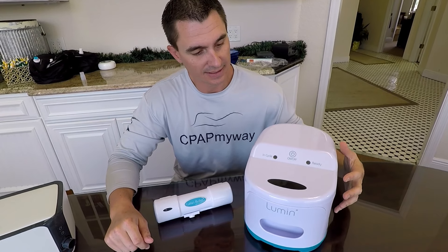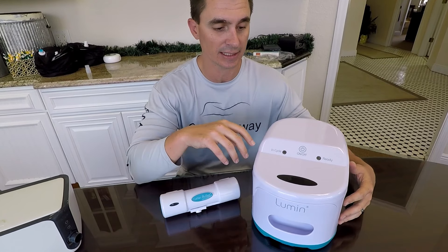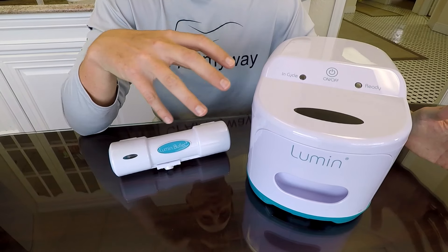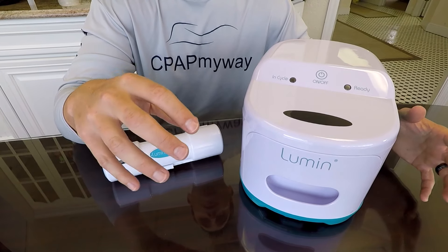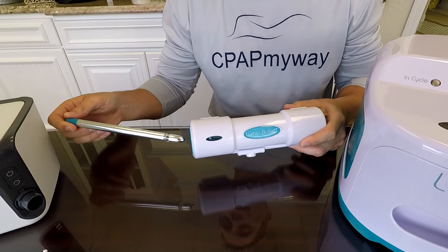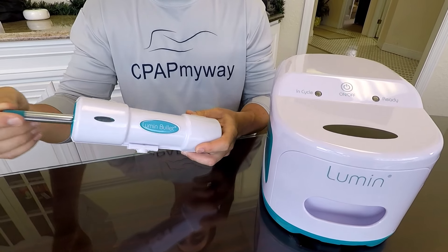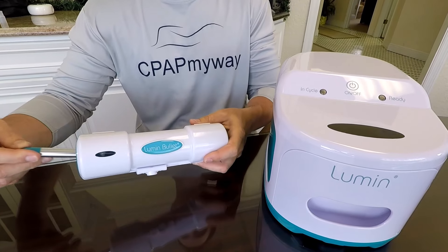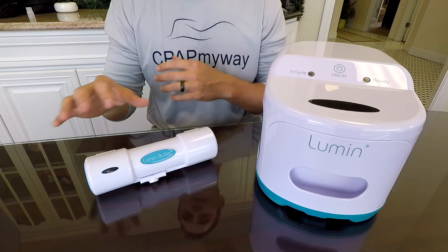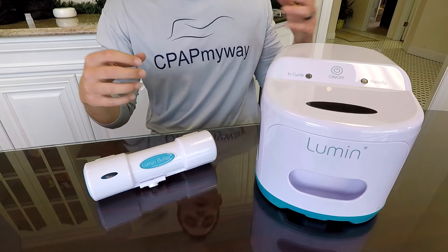The last model we've got for you today is the Lumin and Lumin Bullet. These are a big departure from the previous models because they are UV light cleaners — instead of using ozone, they use UV light. An important thing to remember is that whatever you're cleaning has to be directly exposed to the light. That is why they include the Lumin Bullet along with the Lumin device. The bullet is designed to go through the CPAP tube and be pulled along via magnets, sterilizing the inside of the CPAP tube with UV light. It's a bit of an extra step, but it does it very quickly — you could literally turn your CPAP on minutes later.